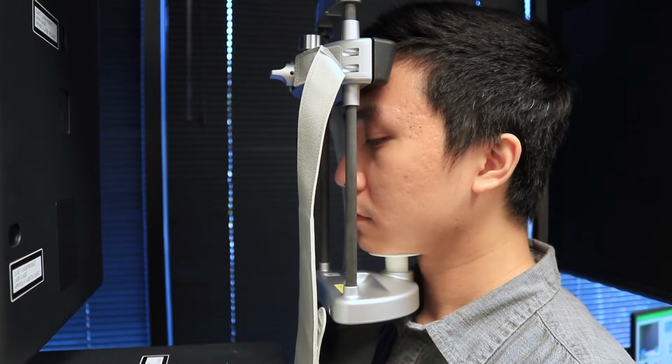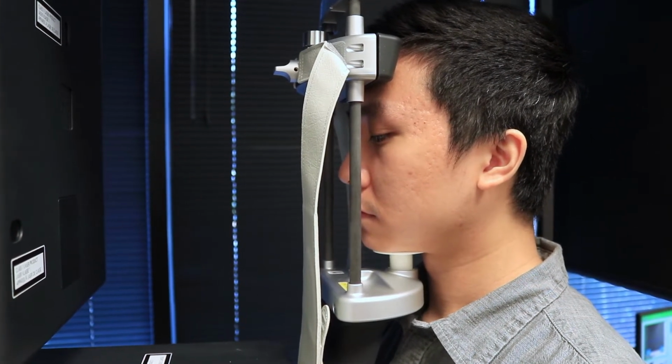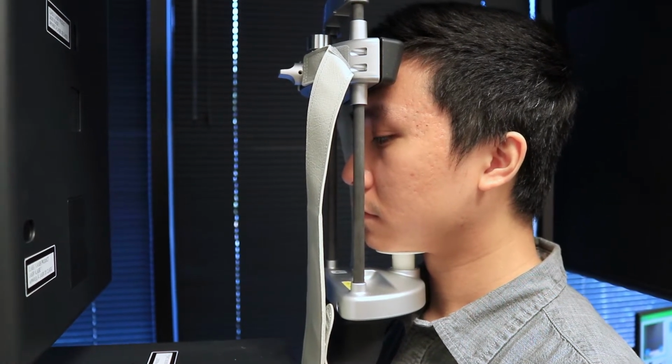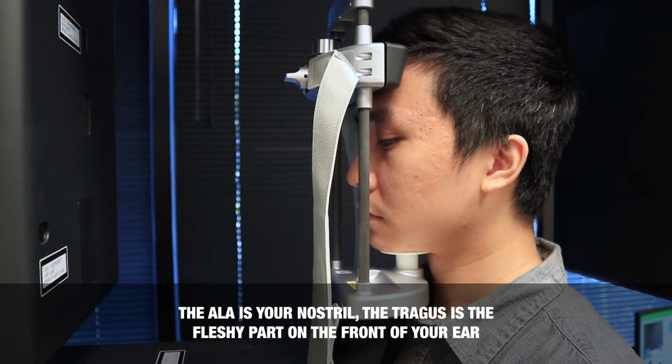When taking a scan, we want the occlusal plane parallel to the floor. To achieve this, we will adjust the gantry height to bring the patient's ala and the tragus of the ear parallel to the floor.